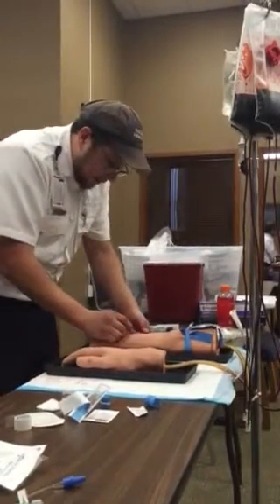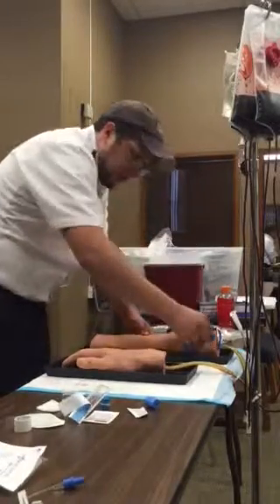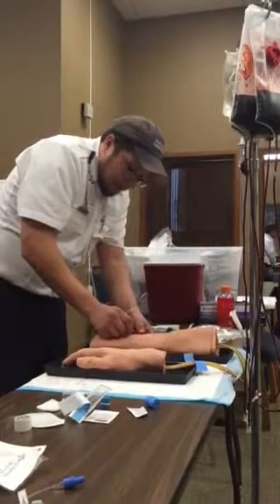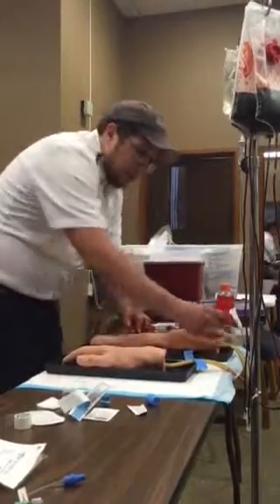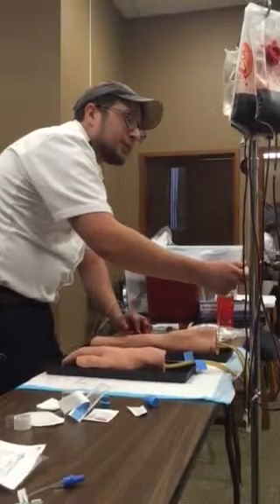Advance my catheter. Occlude my vein. I'm going to dispose of this in a sharps container. I'll take off my tourniquet there. I'll hook up my line. I'm going to open up my line and see if I have adequate flow. You do see adequate flow.